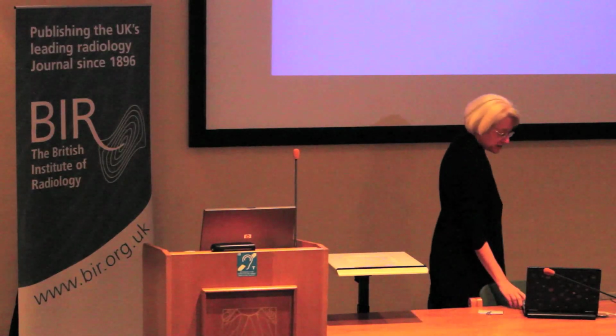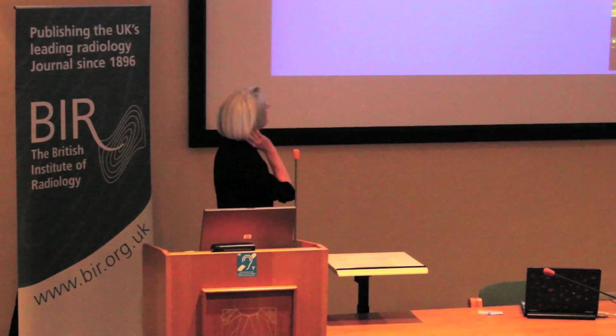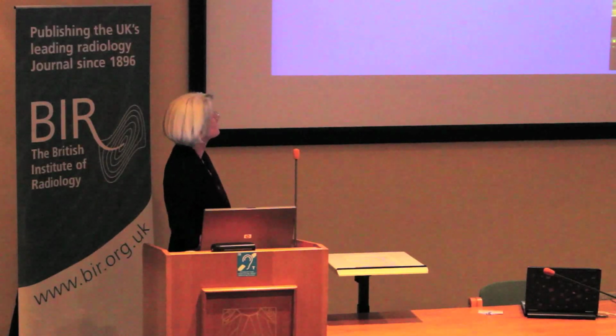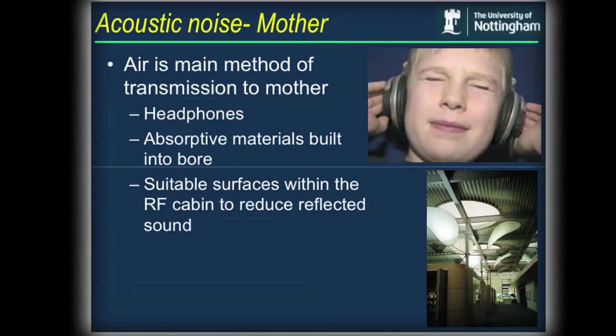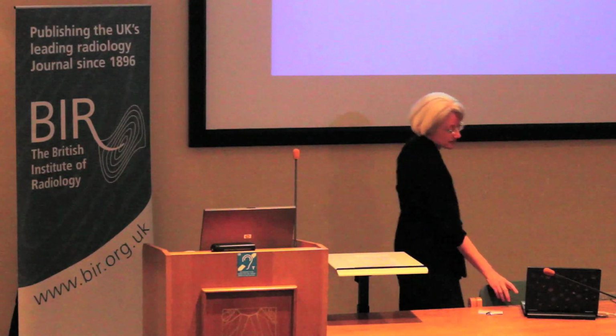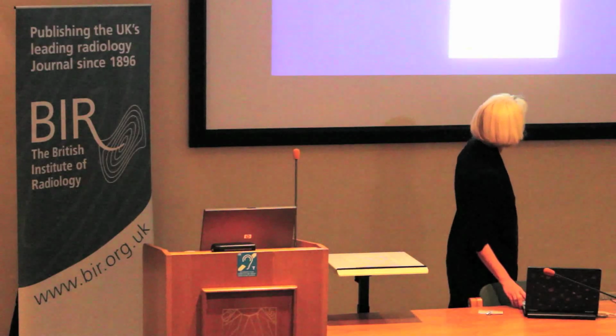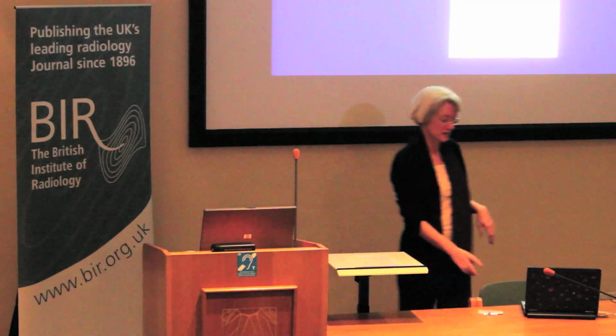The next thing we have to think about with the gradients really is the effect of acoustic noise. Everybody knows that MR is noisy. And in the mother, the main method of transmission of the sound to the mother is through the air. So she wears headphones, and we have absorptive materials built into the bore and hopefully built into the room. And all these things act to reduce the sound within the magnet. They have ear defenders and earplugs, which hopefully make them happy. And also, of course, there's other sound transmission, not just through the air, but through the bore of the magnet, so vibration through their head. So you have foam padding to protect their head from the sound.